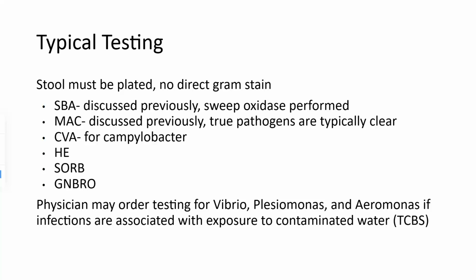So stool must be plated. We typically don't do a direct gram stain of stool. Why? Because there's so much stuff inside of stool. There's a lot of normal flora inside of stool.